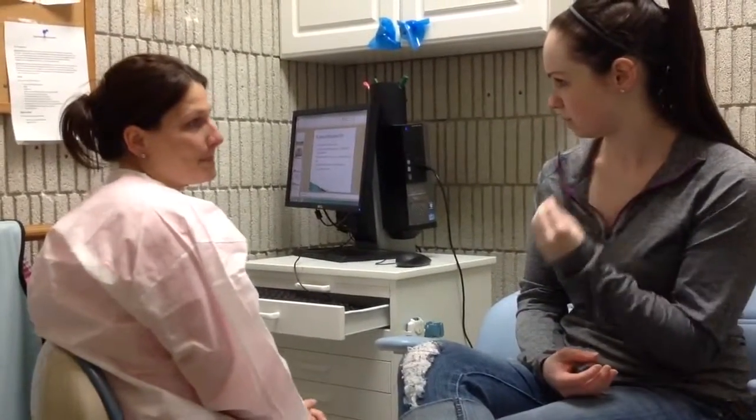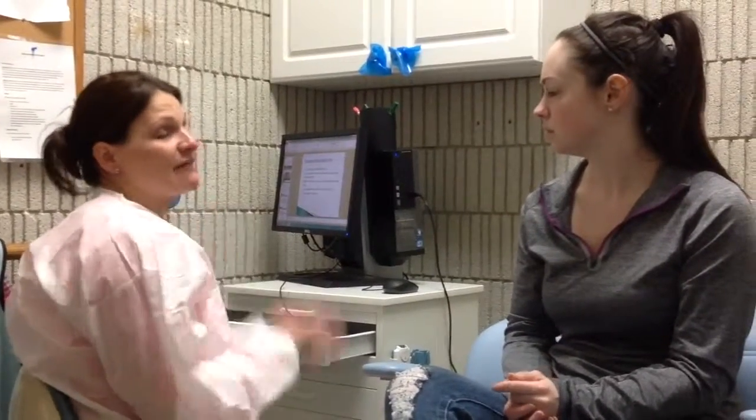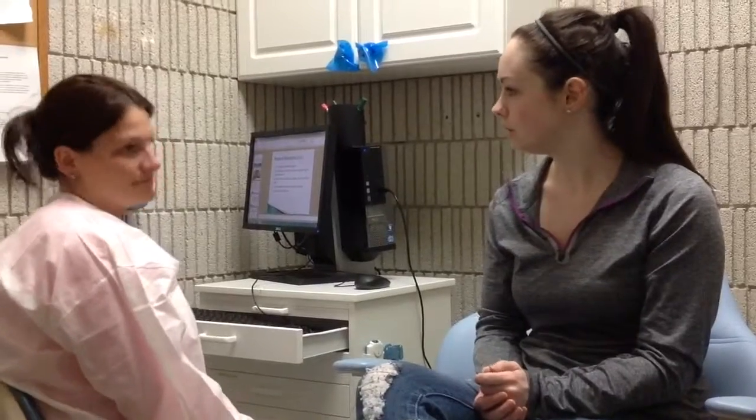Do they have to be pulled? Well, this panoramic x-ray will show us if you're going to need to have them extracted or not, if they're going to cause any trouble in the future for you, so I'll suggest that we get one taken, and we can go from there. Okay.